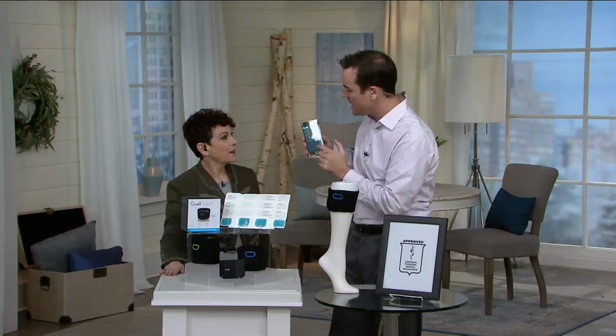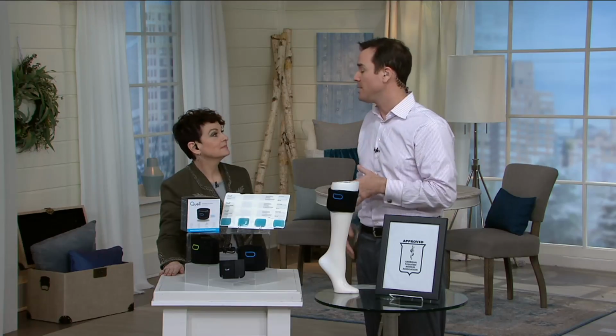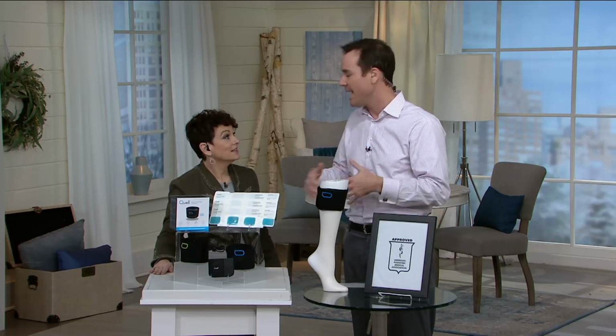And so the nice thing is to be able to share this data with maybe a healthcare provider and to be able to explain to them, hey, doc, I've been having pain and actually it's getting worse at night. What can I do to help? And to be able to share that data.